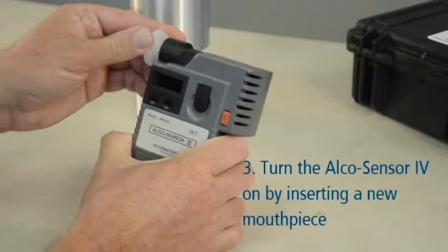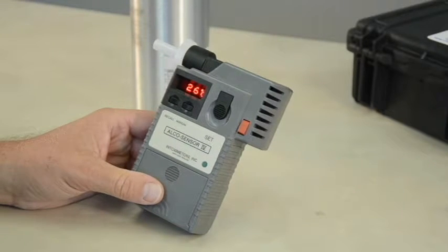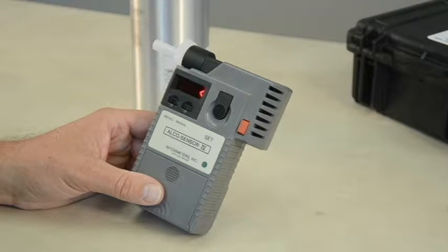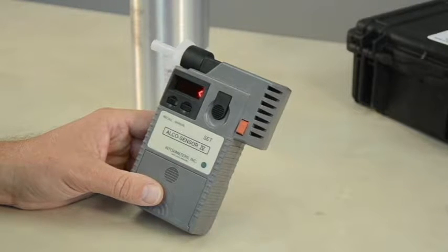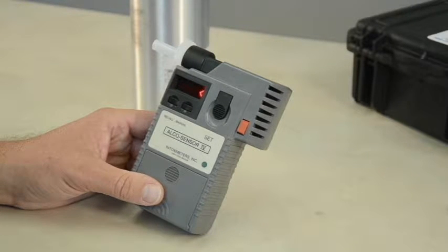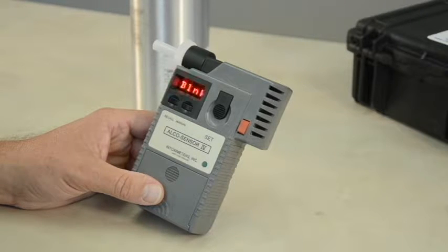Turn the Alkosensor 4 on by inserting a new mouthpiece. The temperature will display. The display will flash the back and forth arrow signs and the word WAIT will appear. The device will then display BLNK. This means the instrument is performing an air blank on the device.